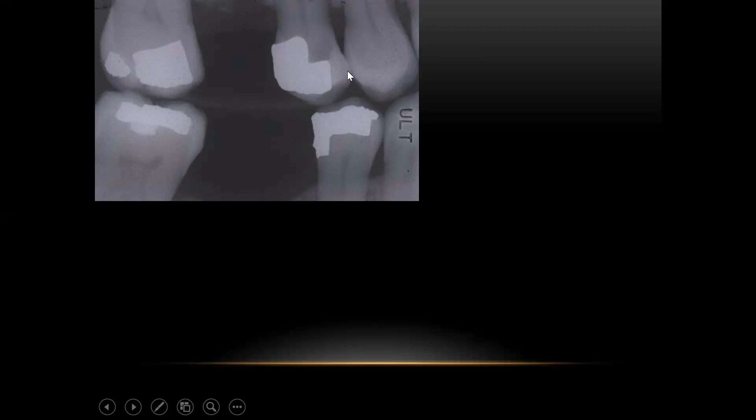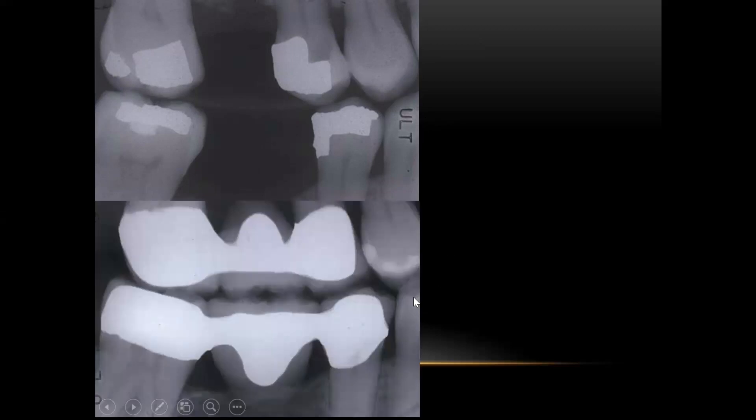When I had it open, I looked at it and found that the caries clinically looked like it was going to go through the enamel, and then there were some catches in the occlusal groove. In this photograph, you'll see that the bridges have been completed — the porcelain fused to metal restorations — and while this was open, I took a small round burr and just cleaned it out. It did go in slightly into the dentin, then cleaned out the grooves which were only in enamel, and sealed them up with restorable composite. This would be an example of minimally invasive dentistry, as opposed to a class two preparation.